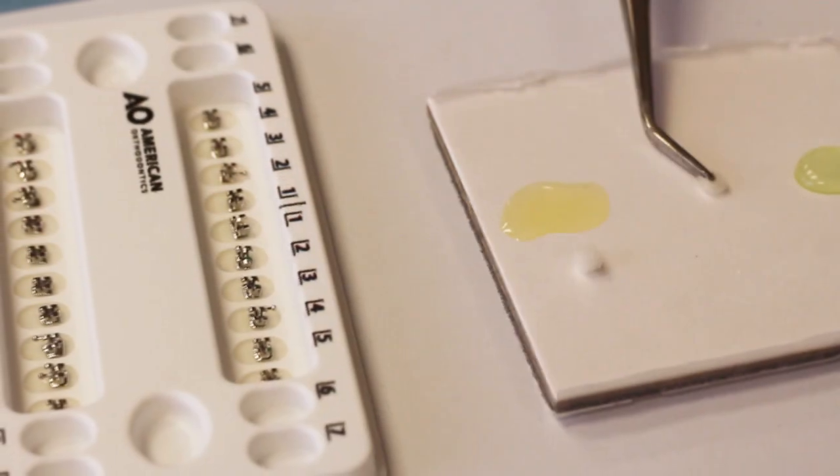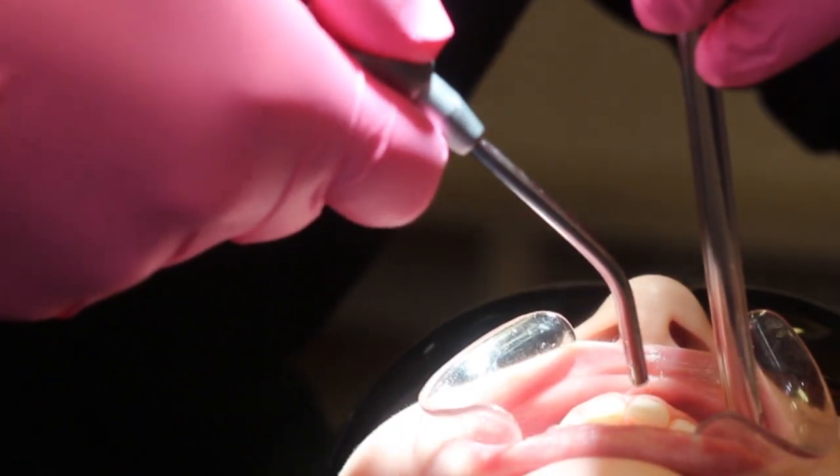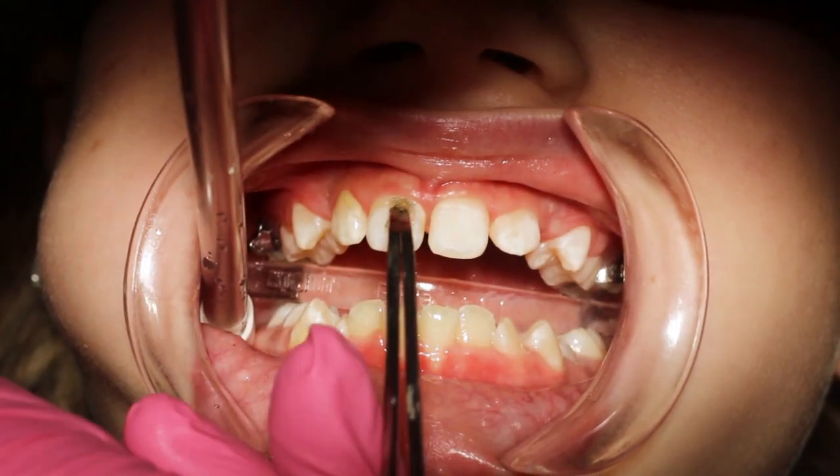What it does is actually kind of makes these little micro undercuts into the enamel. On a microscopic level, you're not going to see a bunch of pitting in your teeth. After we rinse that away, we put on a liquid glue that goes into these undercuts.